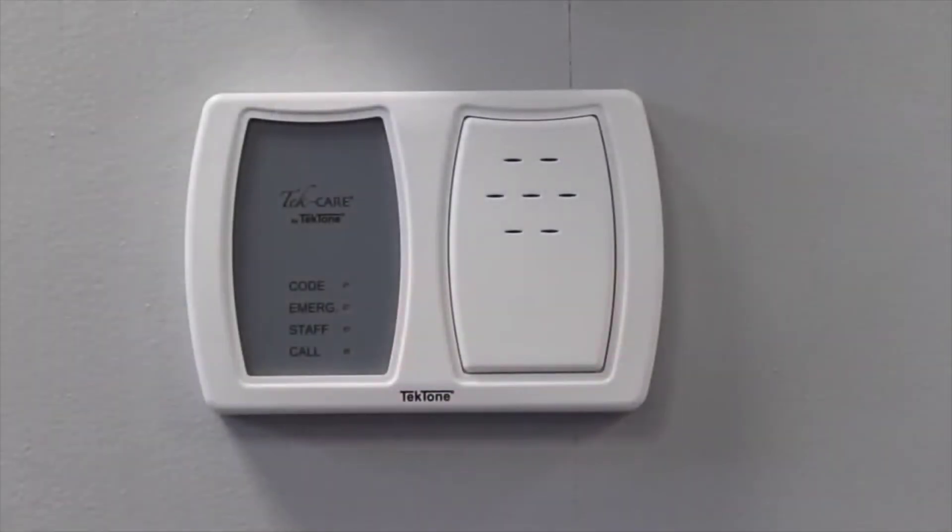Our duty station can be used in work areas where staff need to be notified that there's a call on the system. The duty station features an LED and a tone to alert the staff member as to the level of call.